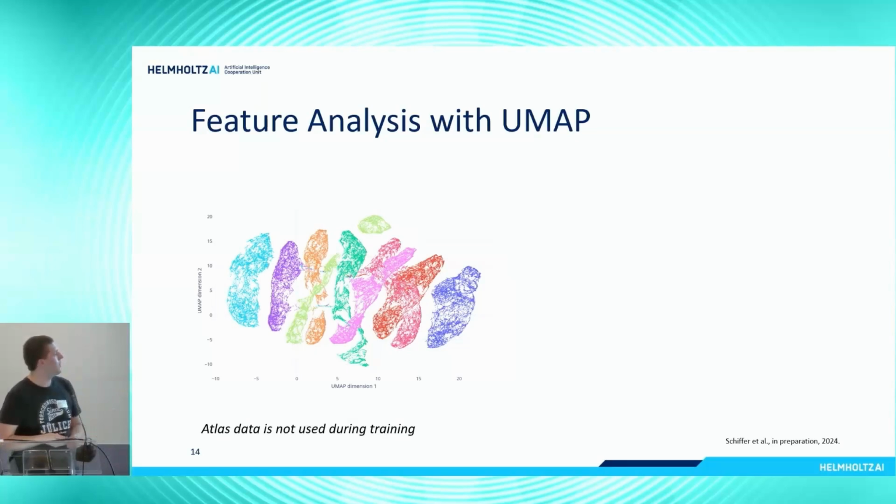This is more of an interactive thing. But what we can see here is the low-dimensional UMAP embedding of features from all the 9 brains that we used, colored by the brain that it originates from. And this is very, very interesting because along the first UMAP dimension, we see very clearly clustered, brain-specific clusters.